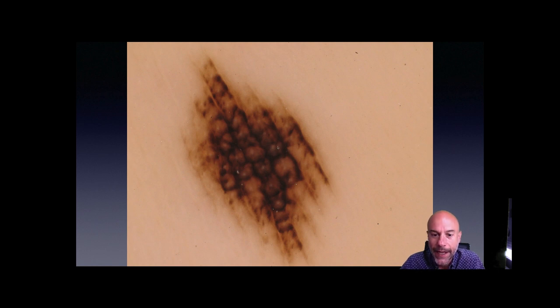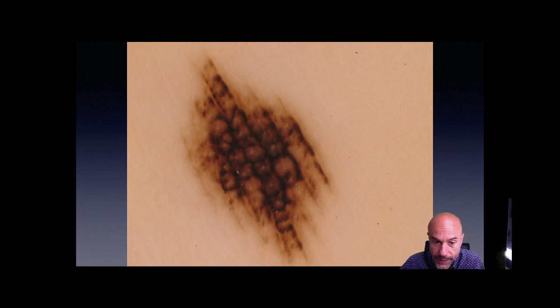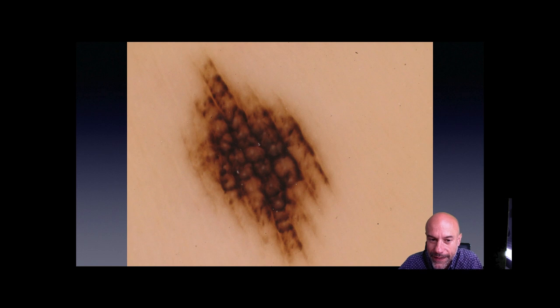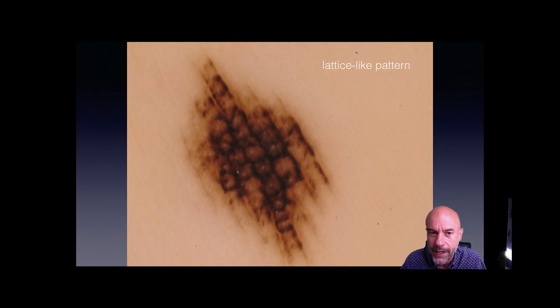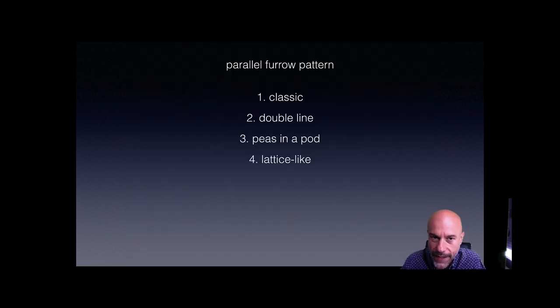In the next image, we can see again a parallel furrow pattern — the pigmented lines are located on the furrows, not a ridge pattern. But in addition, especially in the central part, there are perpendicular vertical lines crossing the ridge. It is not a diffuse pigmentation of the ridge — only vertical lines crossing it. So we have parallel furrow lines and also vertical lines crossing the ridge and furrow, creating a kind of network. In this location, we call it the lattice-like pattern, which is the last variation of the parallel furrow pattern.